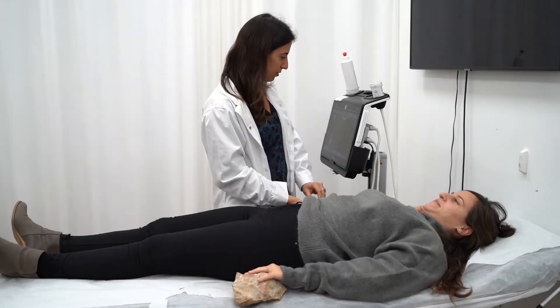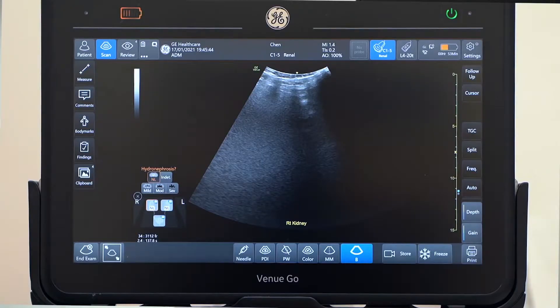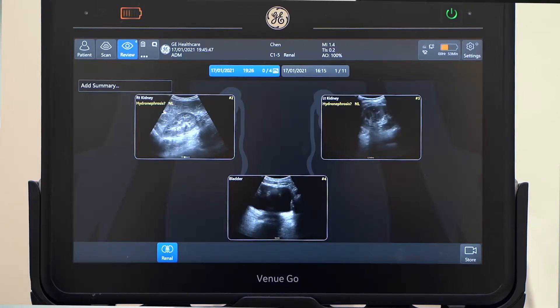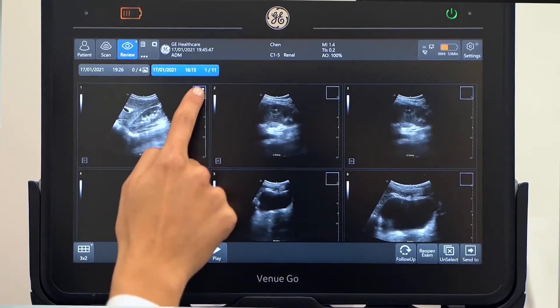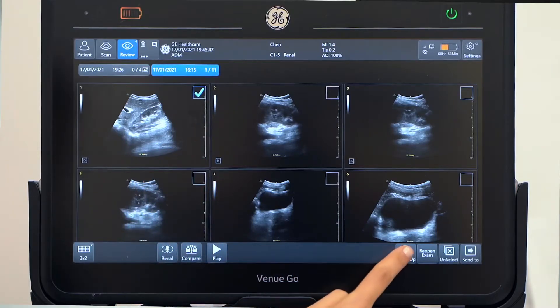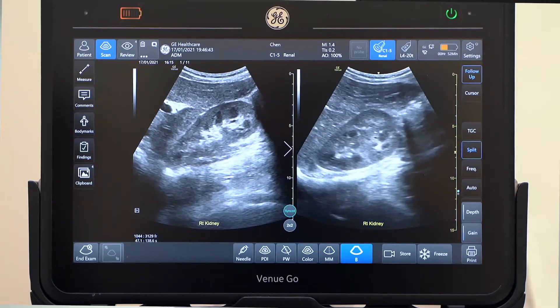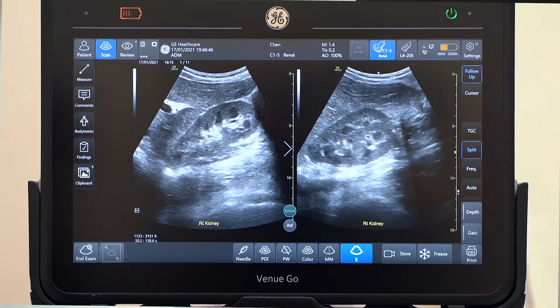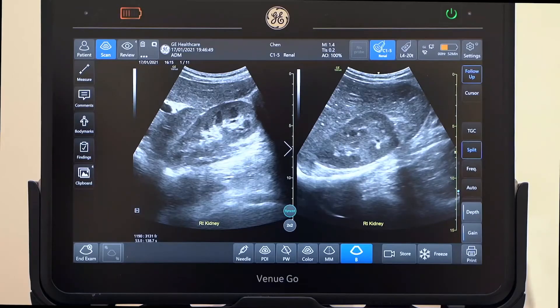We've added the follow-up tool to our Venue family. The follow-up tool is a feature that allows you to perform serial scans on a patient, and you can compare the images side by side. All settings such as B mode, color, PDI, as well as body patterns and comments are automatically recalled from the patient's previous exam and applied to the current exam.